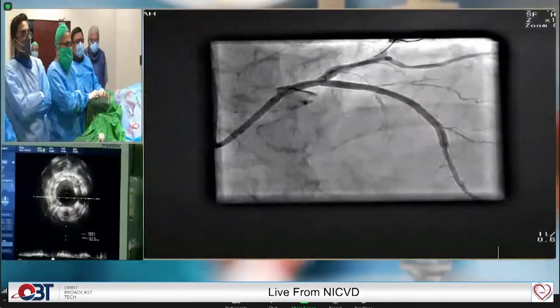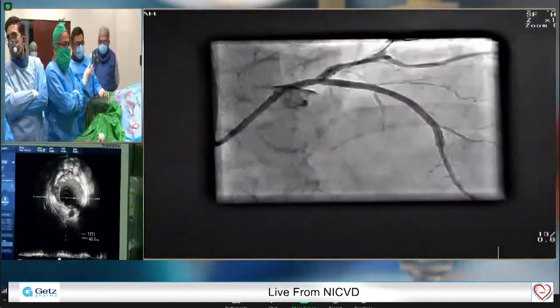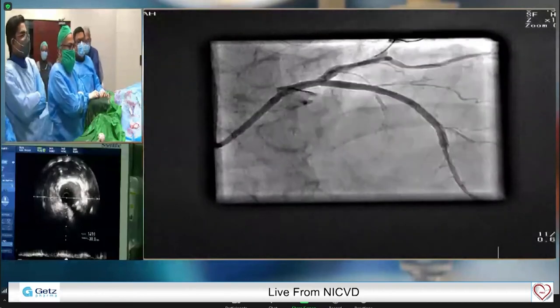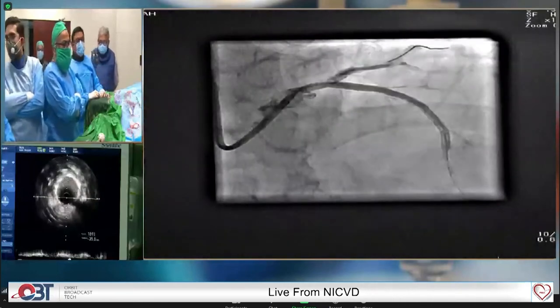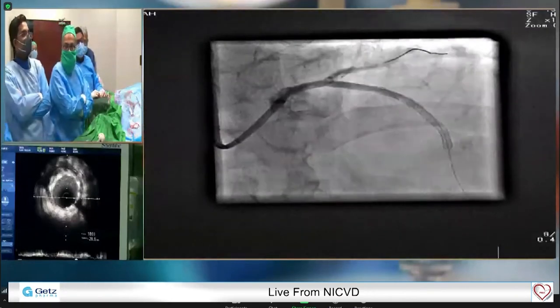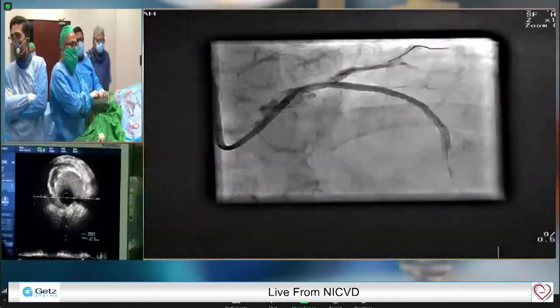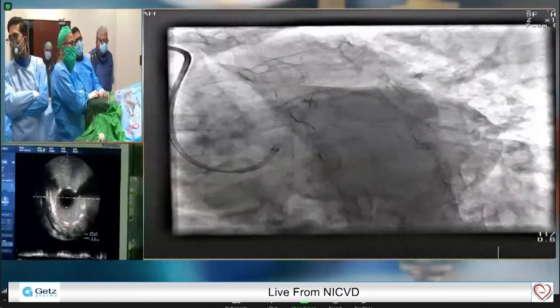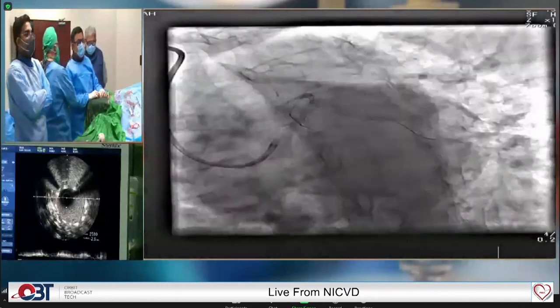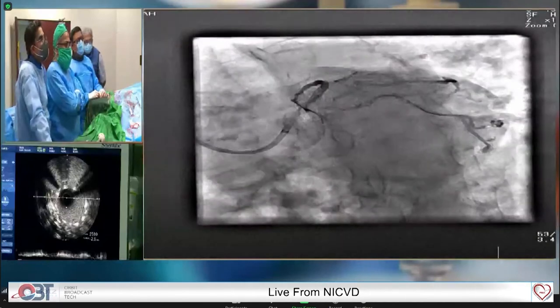Have you done the proximal optimization? We are just now doing post dilatation. We'll do post dilatation and then POT. Till now, what have you seen? Now, what we plan is to recross the wire. But do you want to do a POT before recrossing into the circumflex? There is quite good flow in the circumflex. We are not much worried about circumflex at this stage. It appears that flow in the circumflex has been compromised to some extent. What do the panelists say? Comments, please.